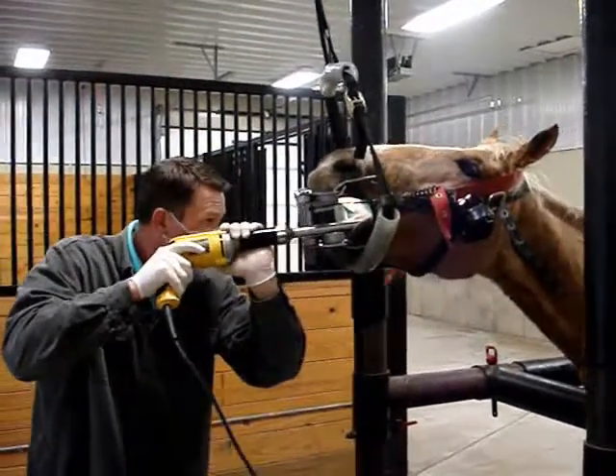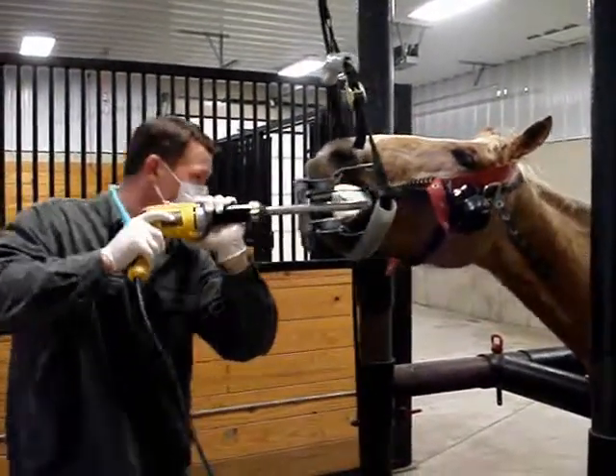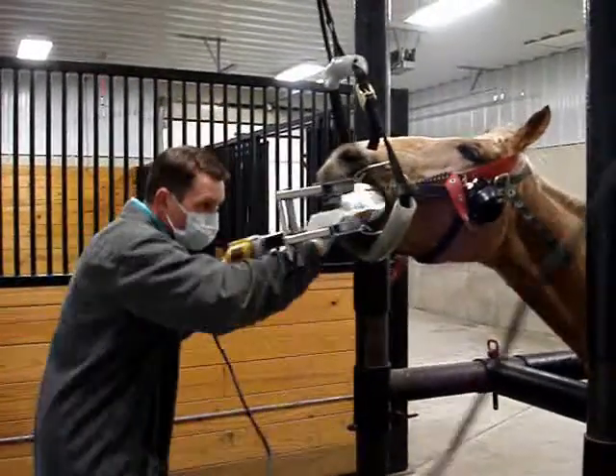Watch closely as we demonstrate the removal of these enamel points off the cheek teeth side of the uppers and the tongue side of the lowers.